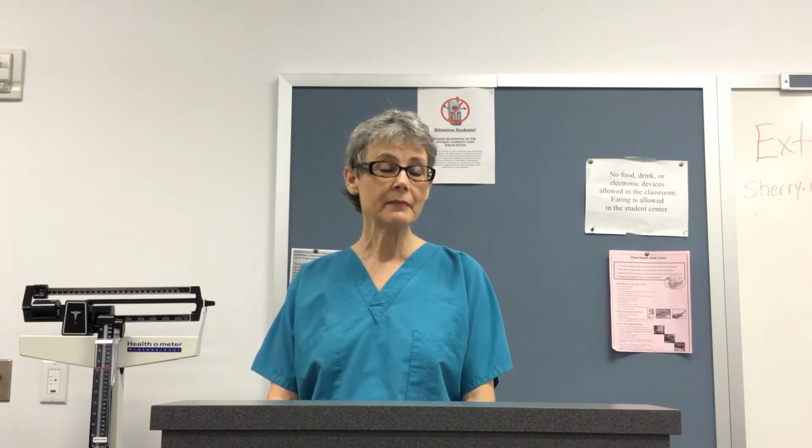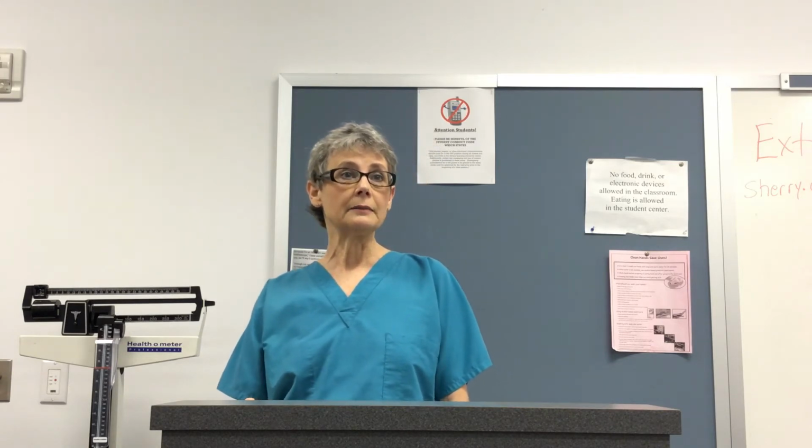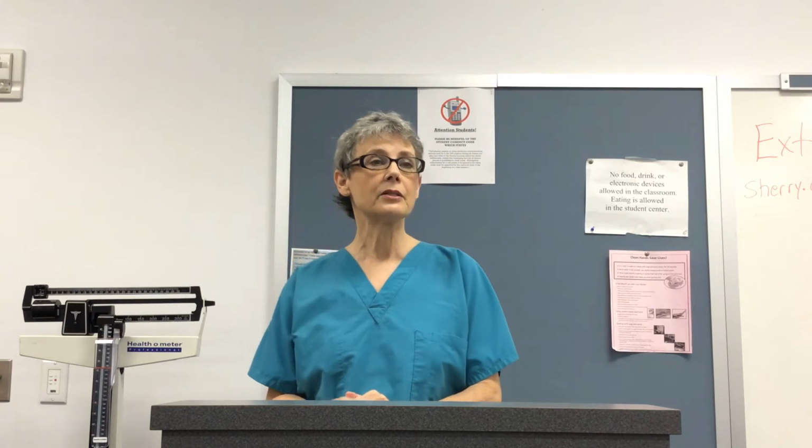You will need to look in the medical history to see if your patient has had a mastectomy, if they have got an AV fistula or a shunt for dialysis, or if they have had a stroke. Those are some things that may affect this, because if a patient is missing, say, the left breast, more than likely there have been lymph nodes removed. So you would want to use the other side, like use the right arm to start an IV.